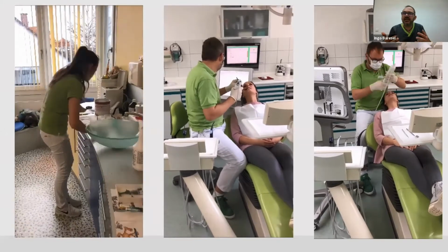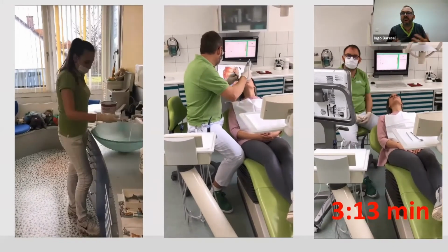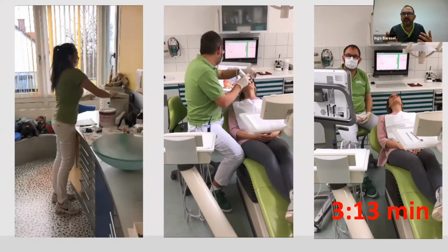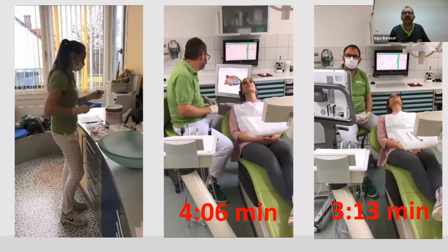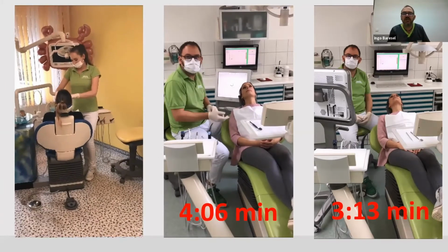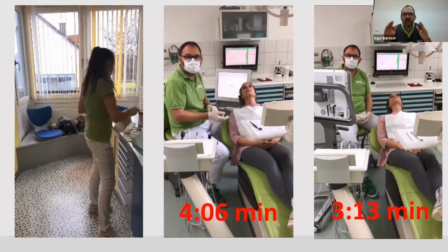Because scanning allows you to scan a patient, as you see, in between 3 minutes. And this was including the palate and everything else. So with the Trios, we have been ready in 4 minutes, just because the software was a little bit slow because it was a better software, but usually with scanners, and it doesn't matter which scanner you use.